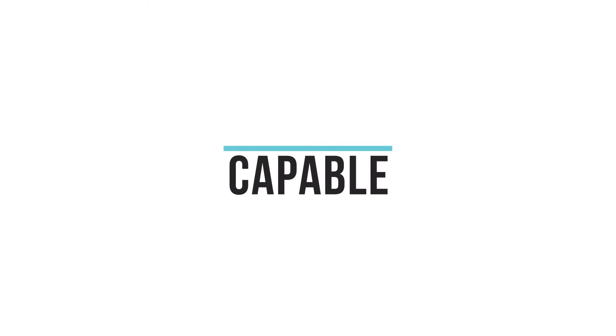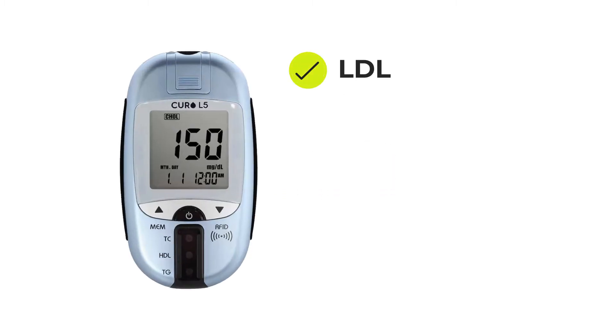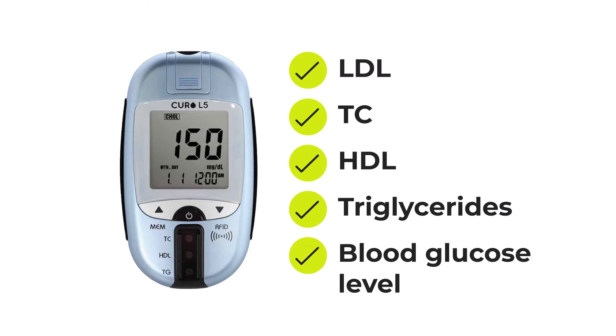It's capable. It screens LDL, TC, HDL, triglyceride, and blood glucose level.